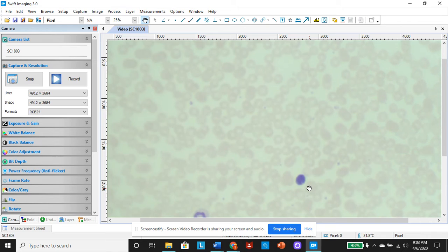Lymphocytes are your T cells and your B cells, and those are the guys that release antibodies and mark other cells for destruction by the monocytes and neutrophils. So these guys are really, really important. It's actually your T lymphocytes in HIV that are affected, and they can't mark the cells properly because the virus goes and infects them.